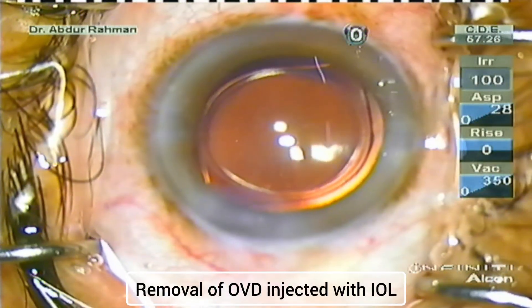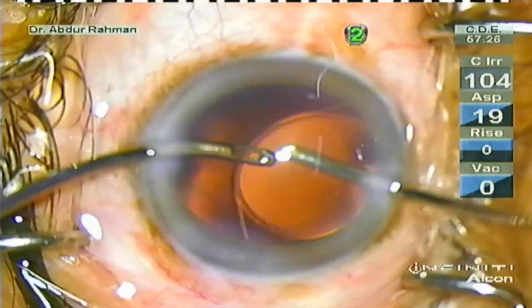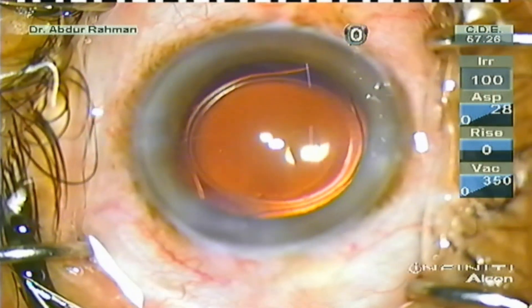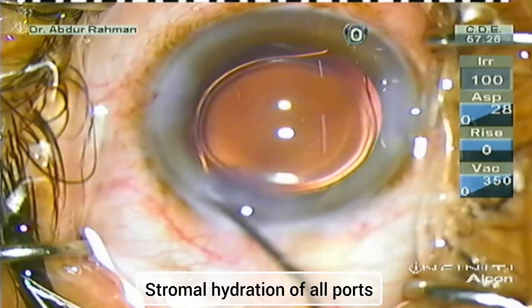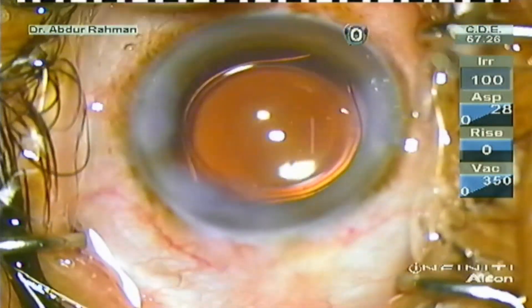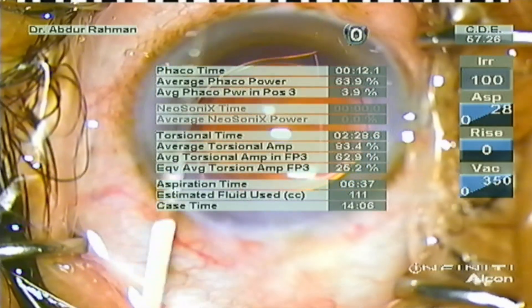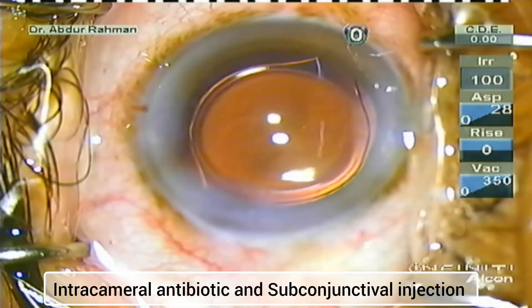Now since there is little OVD, visco removal is pretty fast — about 3 to 5 seconds. Now the case is completed. I'm going to perform stromal hydration of the main port and side port, and give intracameral antibiotic and subconjunctival dexamethasone. The case is completed beautifully.